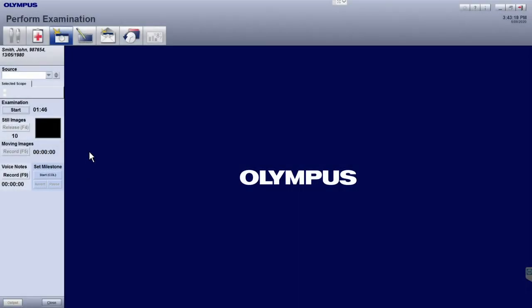The Milestones feature in the Perform Examination module can be used to capture key timings during the examination, which is particularly useful for colonoscopies. These buttons can be customized in terms of both labeling and the number of milestones you wish to capture.